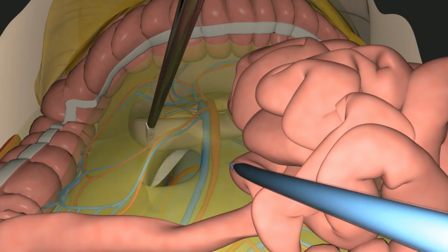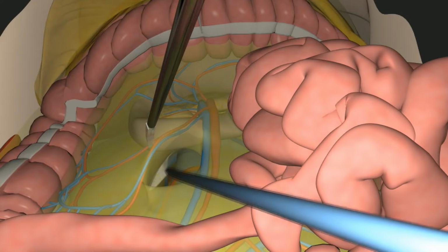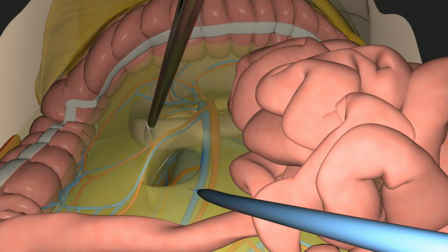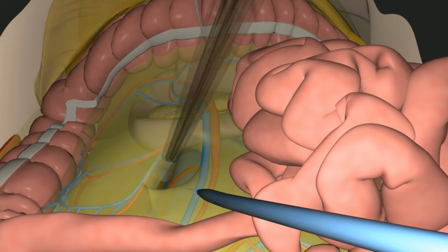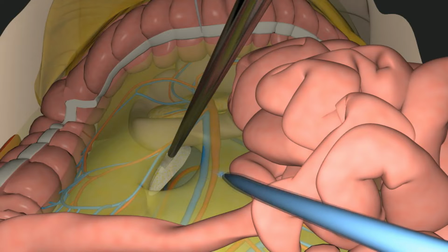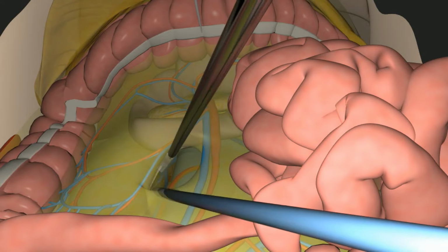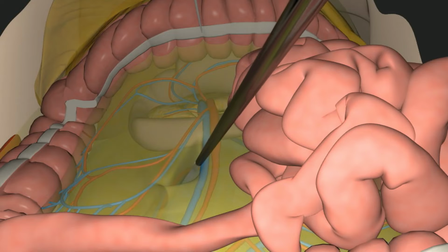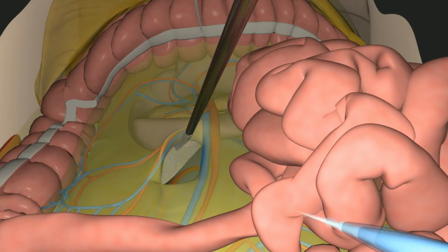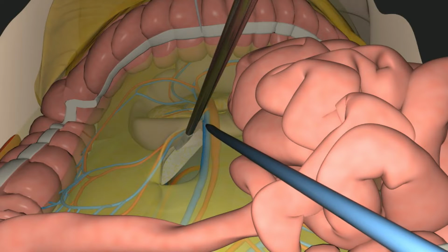A non-crushing bowel clamp is placed on the mesentery just at the ileocecal junction. This area is then stretched up toward the right lower quadrant, stretching the vessel and also lifting it up from the retroperitoneum. In almost all cases, this demonstrates a sulcus between the medial side of the ileocolic pedicle and the retroperitoneum. In order to enter the correct surgical plane between the visceral and the parietal peritoneum, the visceral peritoneum covering the superior mesenteric vein is being divided along its axis.